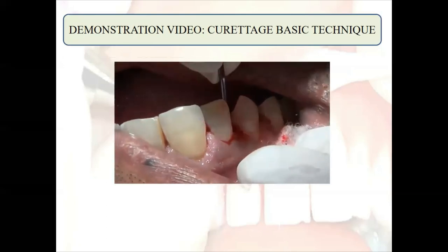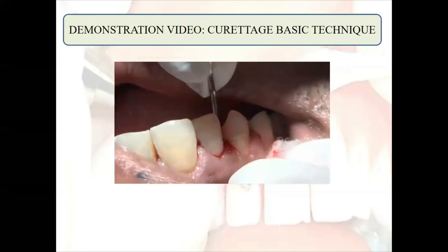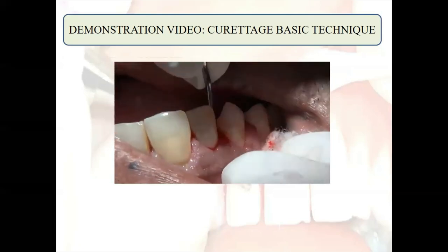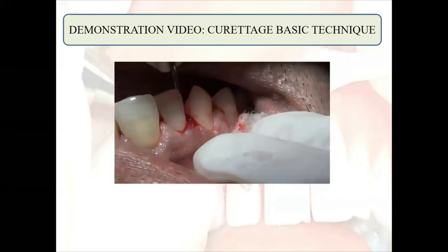You can clearly appreciate the different strokes which are given in a repetitive motion. And in order to remove the base of the pocket, a scooping motion is given with the help of the curette only.